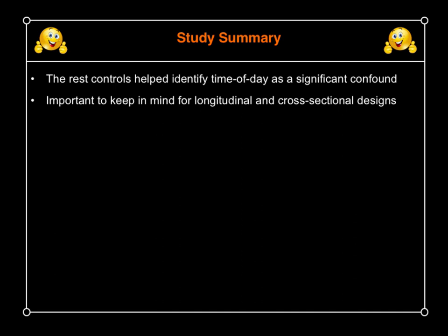Even in cross-sectional designs, your patients are probably more available during the AM in the day, and because the healthy controls tend to come to the scanner after their work, you might have a systematic bias in how you scan your two groups, and you might have differences purely because of that, rather than any pathology. So even for cross-sectional designs, it's an important thing to keep in mind.